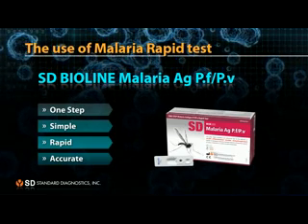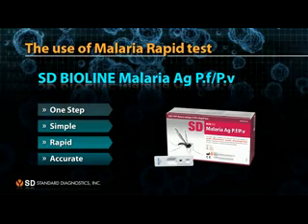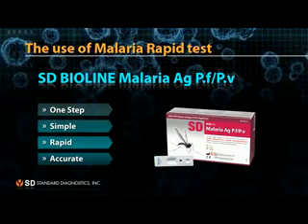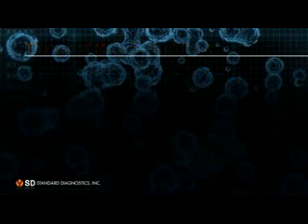Malaria Rapid Diagnostic Tests, RDTs, assist in the diagnosis of malaria by detecting evidence of malaria parasites in human blood. The SD Malaria Antigen PF/PV rapid test is a one-step, simple, rapid, accurate test.